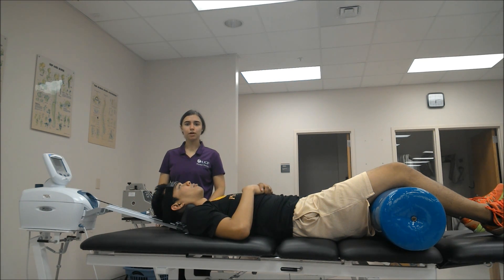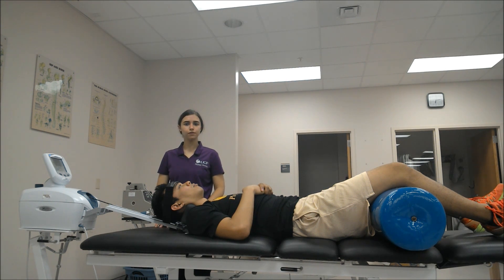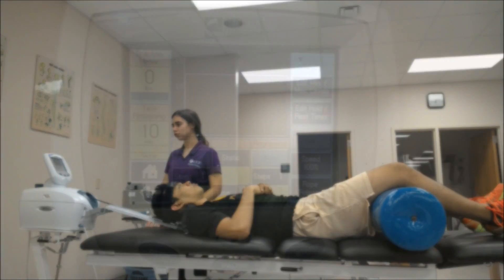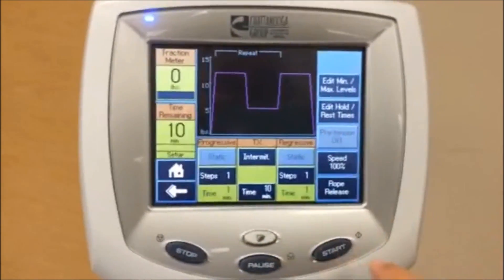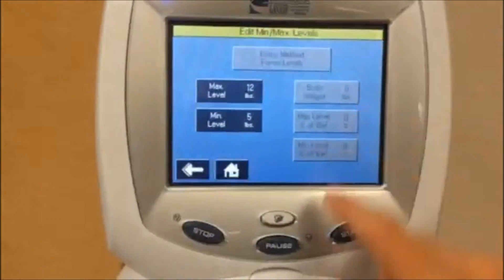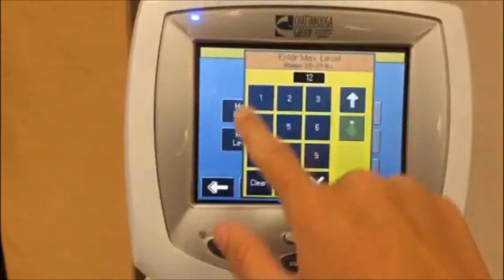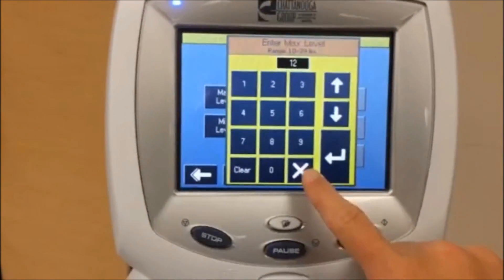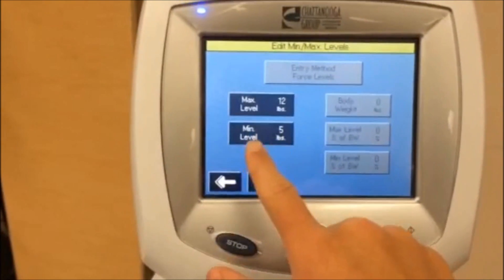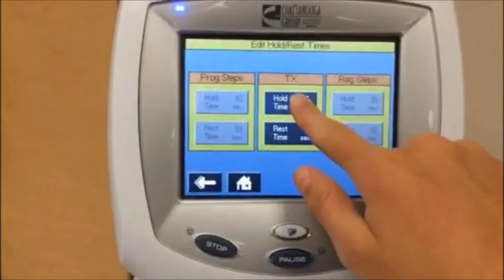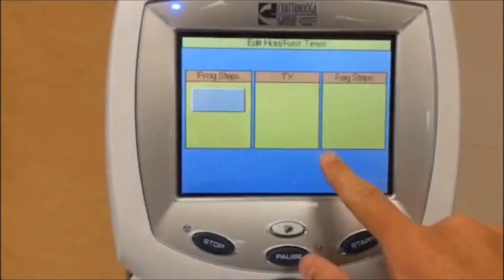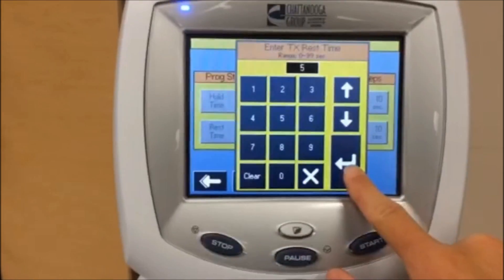Now for parameters, generally for decreasing muscle spasm, a force of about 12 to 15 pounds is effective. We'll be using just 12 pounds since this is his first treatment. To set the parameters on the screen, first choose intermittent traction, then select edit min-max levels — today we're going to be using 12 pounds as the maximum and between 0 to 5 pounds as your minimum. Then select edit hold-relax times: 5 seconds on, 5 seconds off today, to decrease muscle spasms.